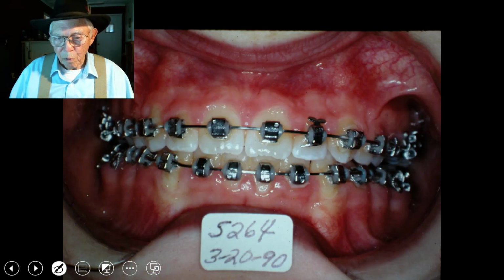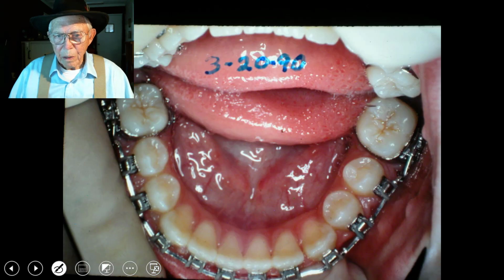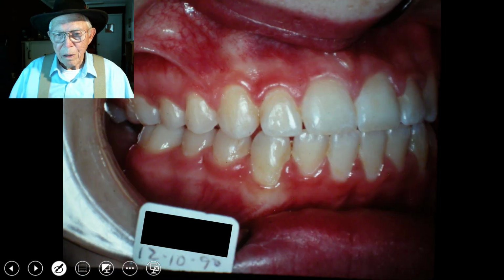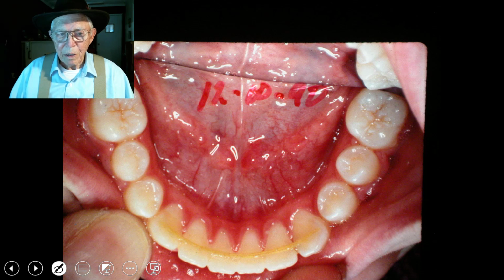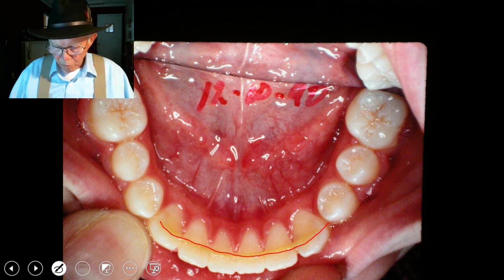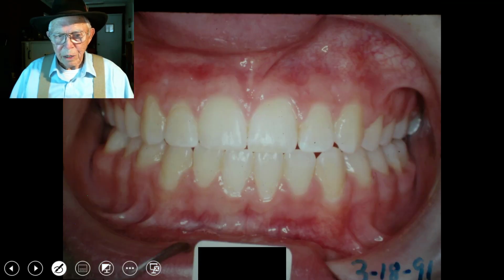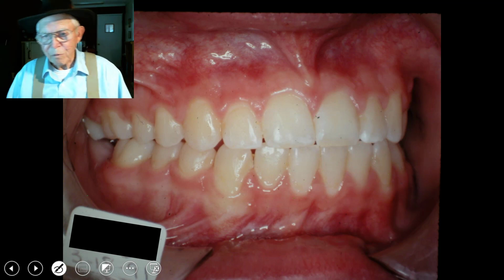Alright, now we've got overbite, overjet, and we're virtually through with the case. Now, she moved forward over that in '90, but we've still got some overjet and overbite. Now, we had a little 3-to-3 on her, but I don't like those strings. I'd rather have a wire go in there, and then we'll bring that wisdom tooth up in position there after it's corrected that way. So this is it at '91. It's pushed back out to kind of that form it was in to start with.